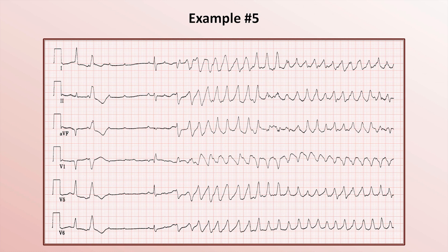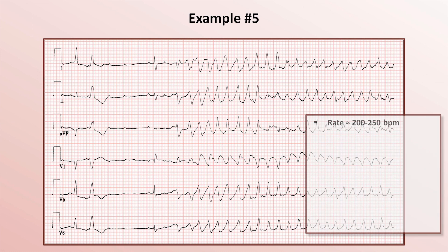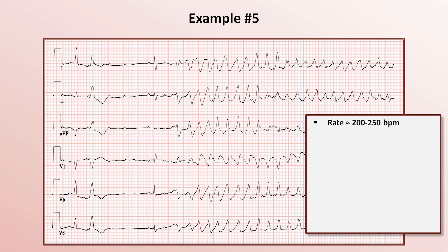The rate is very hard to say since it's irregularly irregular and we don't have a full 10 seconds to evaluate it, but we can estimate it's somewhere between 200 and 250 beats per minute. Once the rate exceeds 200, an exact number is not very helpful.